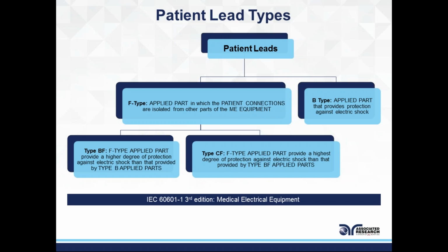So having those protections put in place, I still have to verify that there's no stray leakage making its way through the protection I just put in. So when I have two means of protection between my live circuit and my applied part, I'm running a patient leakage test to make sure that when my product is powered up, it doesn't leak any current towards the applied part.